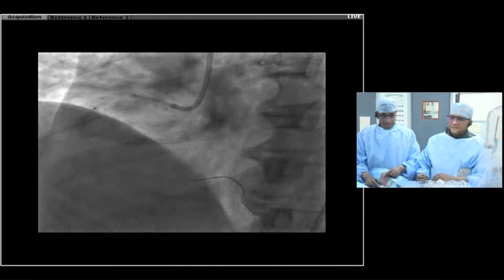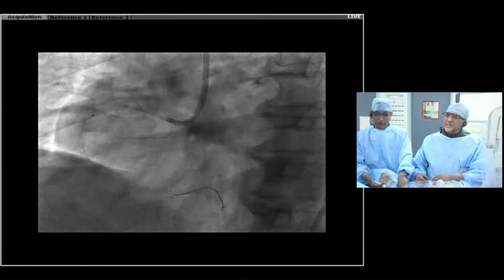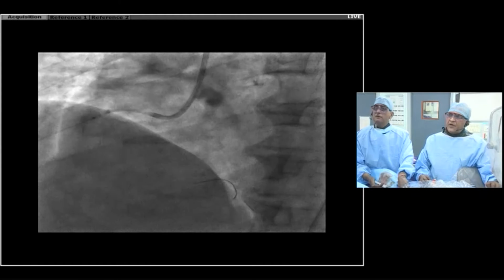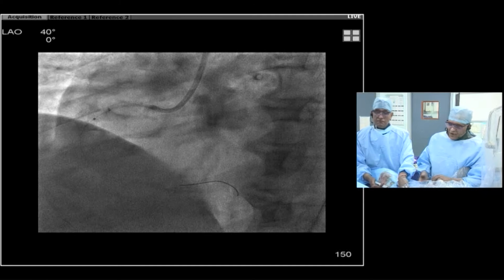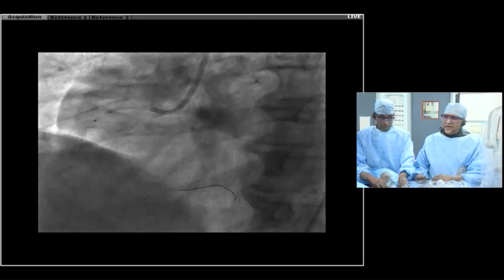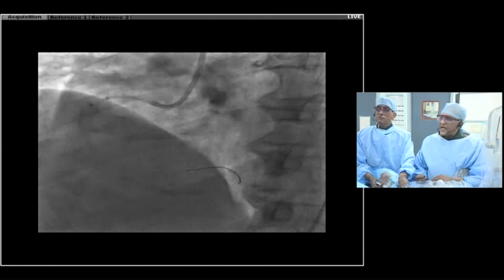So it looks like that distal cap is a little resistant. Yes, it is, and we won't have an issue with going with a little bit of contrast later on, but I would be very careful. Sometimes you don't really need to cross it. You do enough alteration of that plaque, but you know that laser doesn't go through calcium. Okay, go, inject.